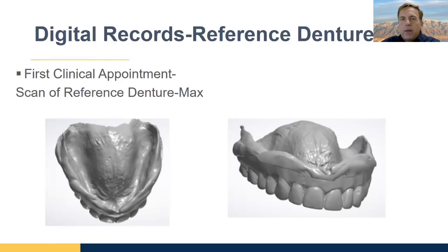Can you go over what steps to do again after scanning the reline impression? Absolutely. What you want to do is take this 360 scan that we've been talking about and then scan the opposing arch. It's probably easier to do with the denture out. Then put the denture back in, put the bite that you've trimmed in, have the person close into that, and take a bite scan on both sides.